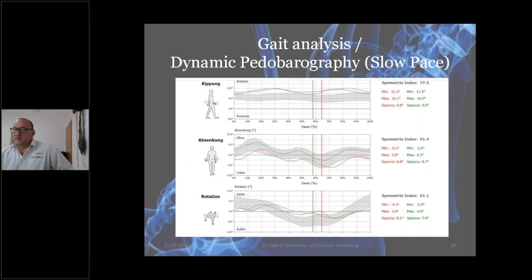And that might still lead to one leg being further down than the other, or some of the radiologists might claim on a 2-dimensional X-ray that one leg might be shorter than the other one, which is just maybe a wrong analysis of a 2-dimensional X-ray.